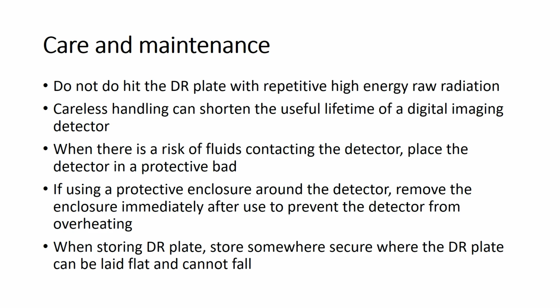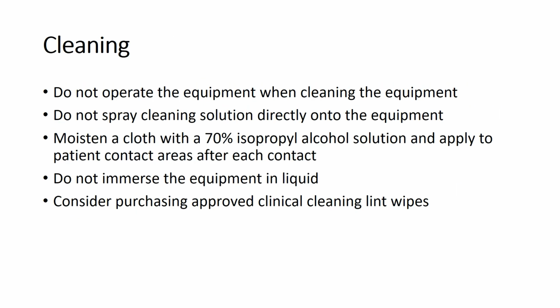When storing DR plates, store them somewhere secure where the DR plate can be laid flat and cannot fall. So, these are certain important points you should keep in mind for care and maintenance of the DR system.